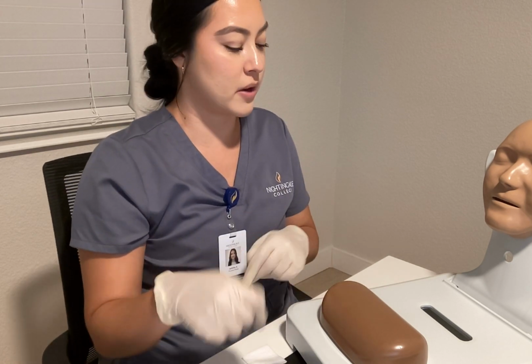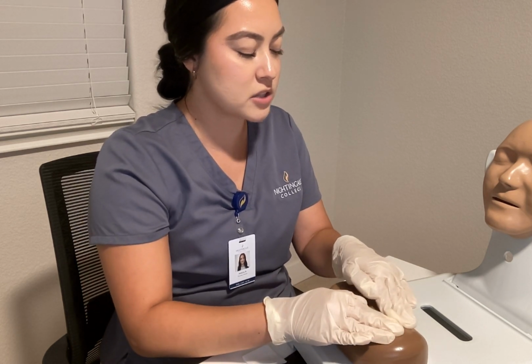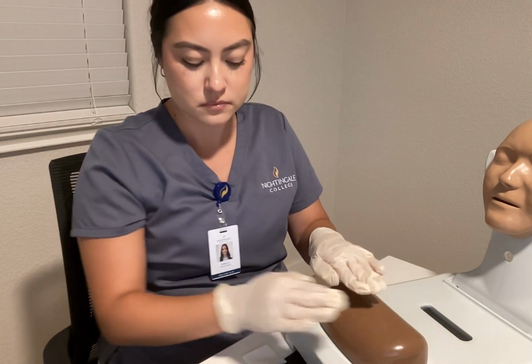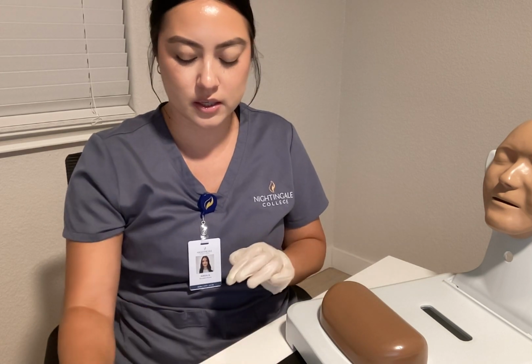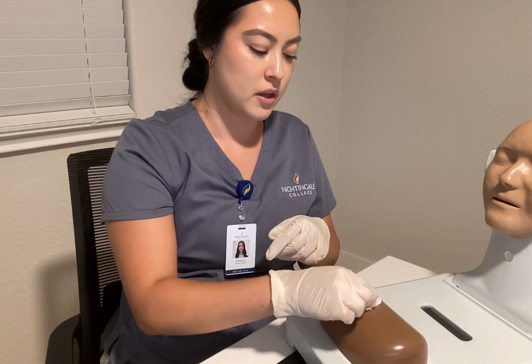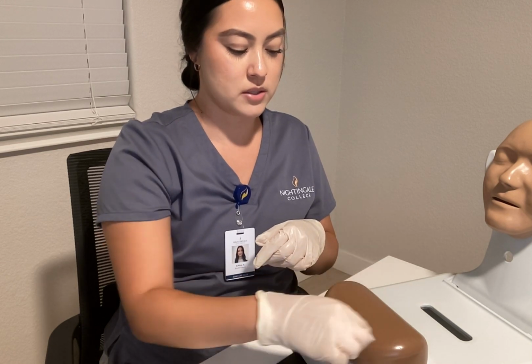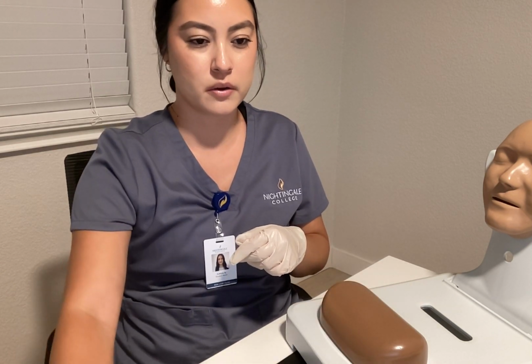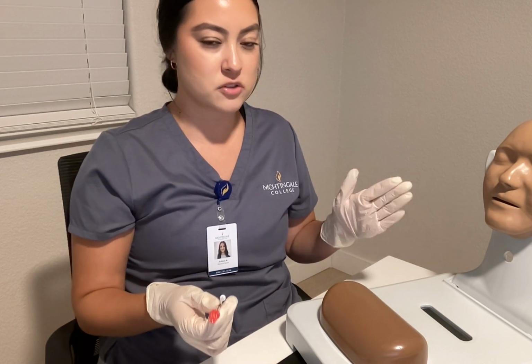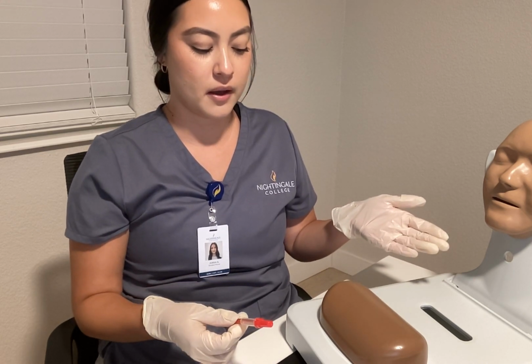All right, Mr. Smith, I'm going to go ahead and lift your shirt. Skin looks good. Any tenderness or pain touching your abdomen area? Everything feels fine. That's great. Okay, we're gonna go ahead and clean the site. So we're gonna take this, and with cleaning, you're just gonna start from the middle, and you're going to counterclockwise clean outwards. We're gonna go ahead and throw this away, and we are going to let this dry. You do not want to wave it, you do not want to blow it, you're just gonna let it dry by itself.